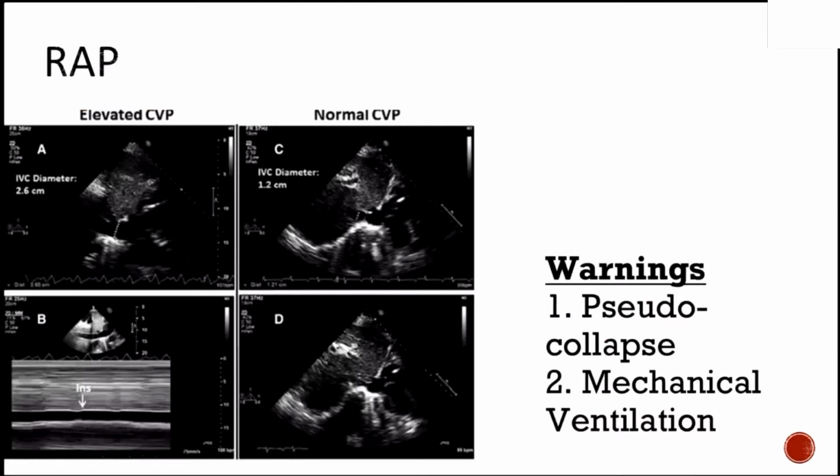You're going to allow for the gradient to be lower in the thorax. The pressure in there is less, so blood flow is going to come downhill into a lower pressure system, which is the thorax. So that respiratory variation is what we're going to use to help estimate our right atrial pressure. Basically, we're trying to see what the central venous pressure is, and we're assuming that's equal to our right atrial pressure, okay?